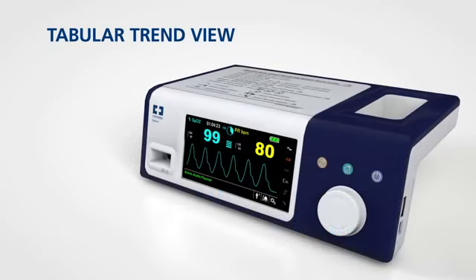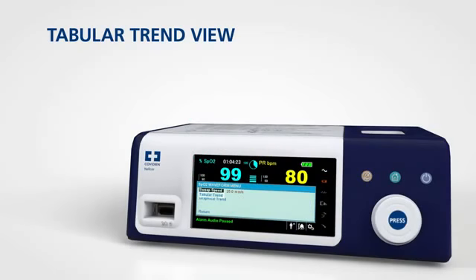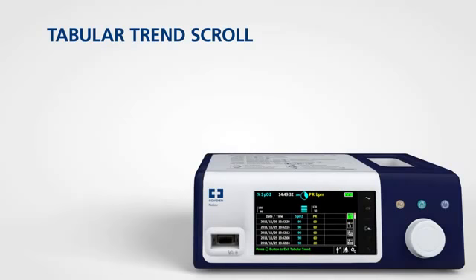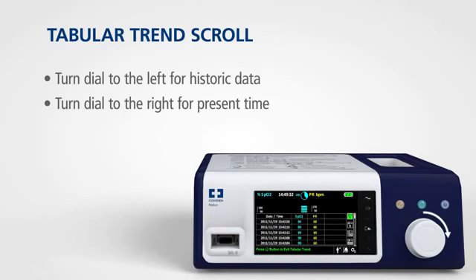To access the tabular trend view, rotate the jog dial to highlight the waveform or trend display area and press. Select Tabular Trend and press again. To scroll through the tabular trend view, rotate the jog dial to the left for historical data or to the right to get back to present time.